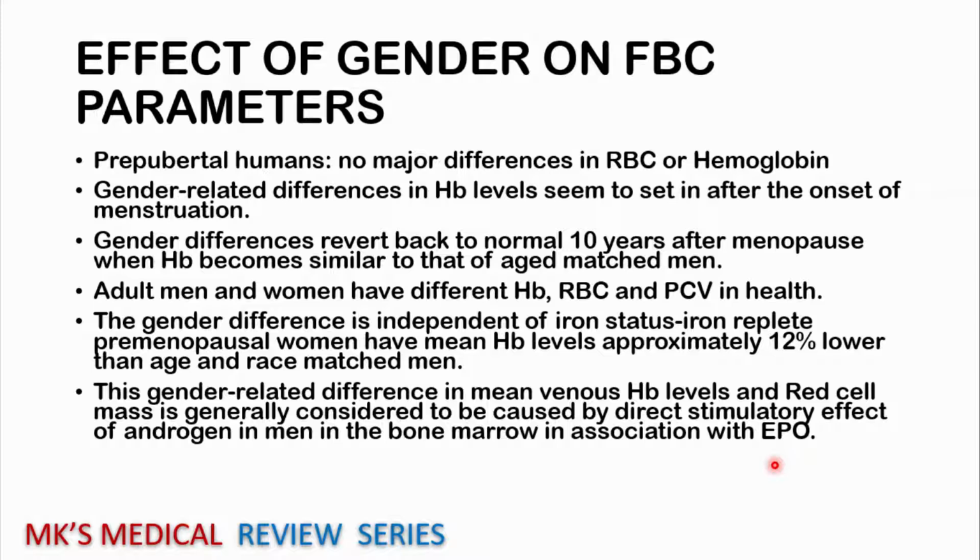But enough about this physiology. Let's now go into the different parameters of the red blood cells so that you get into the gist, and you should be able to know how to interpret the hemoglobin levels, how to interpret the RBC and other parameters. And in essence, when this lecture is done, you should be able to interpret the hemogram.